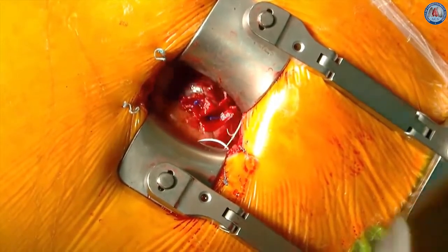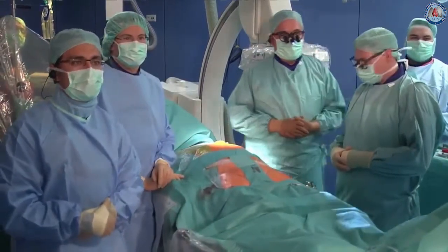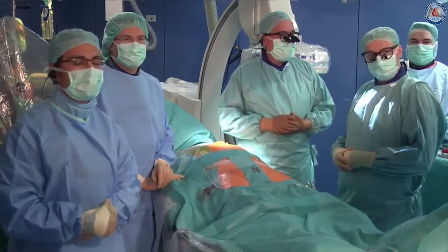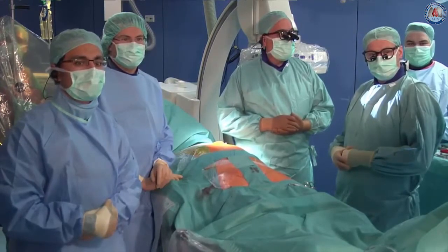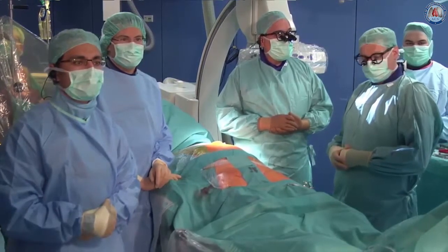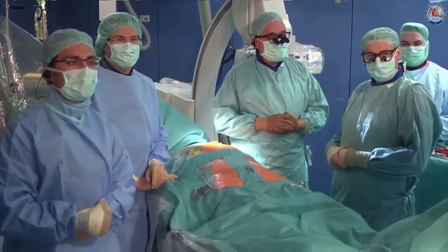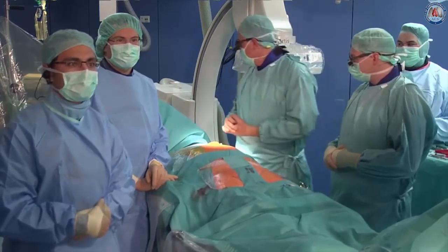Thank you very much. Dr. Bavaria has another question. Yes, please. Yes, I was interested in how you did the commissural alignment. In other words, how did you get the commissures into the coronary sinuses equally? Did you use echo, or did you just use the fluoro? Just the fluoro, that's it. And is there any way to tell afterwards whether you did it right or not? Oh, yes, we can. Maybe we can check that.